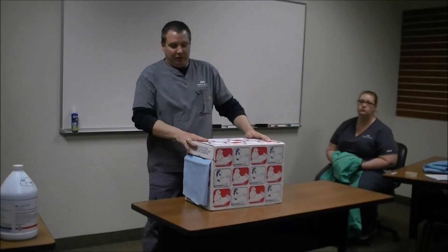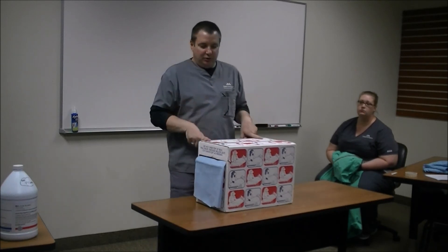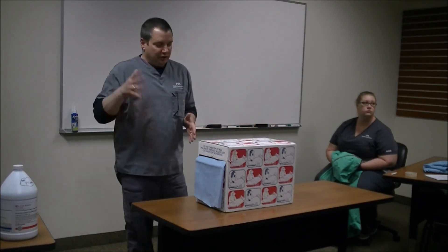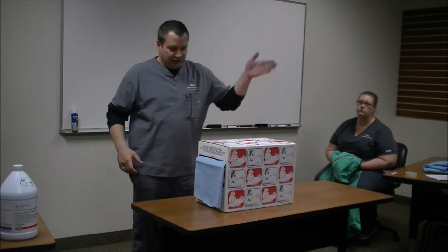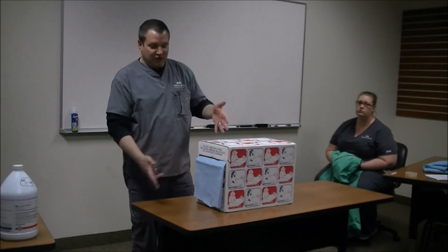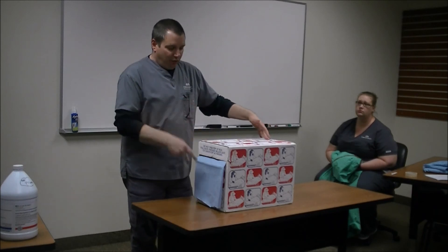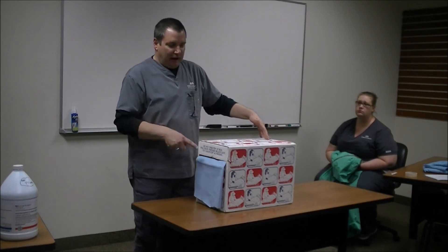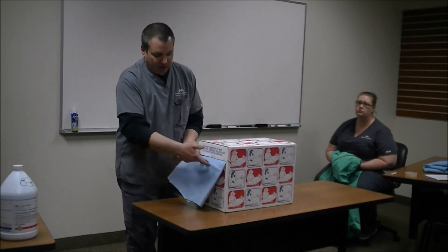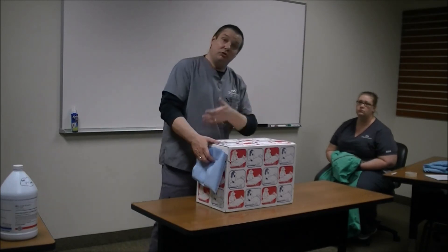Now we'll talk about how to get the appropriate drape size. This is located in room 105 on the right-hand side of the hand-washing sink, on the bottom shelf. You open it up and on the inside of the cupboard there's a chart explaining the drape sizes — a dog gets two and a half folds, a cat gets two folds, and a pack gets two folds. You pull it out and measure the folds: this would be a half, and you pull it out to your next fold. That will determine how much drape material you need.